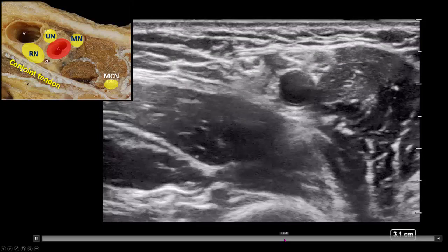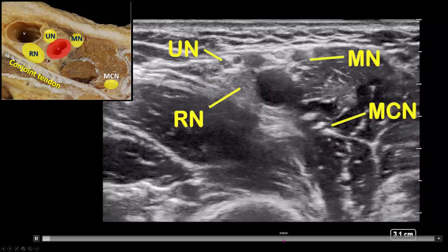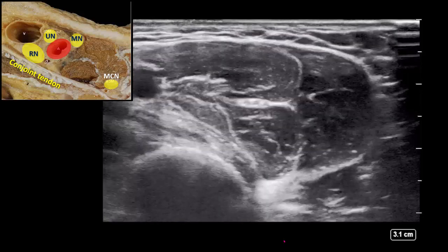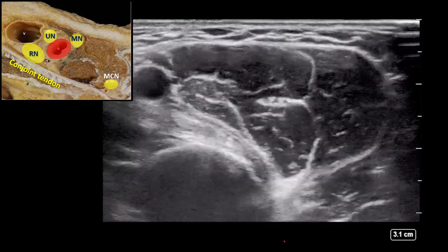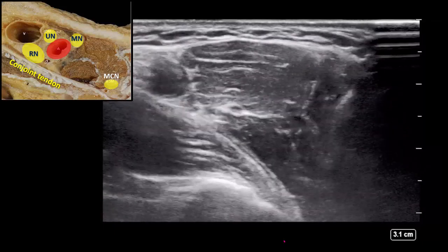Tilt the probe as needed to optimize visibility of the arterial wall, fascial planes, and the nerves. The musculocutaneous nerve location is variable and is identified as a sliding structure within the coracobrachialis muscle.